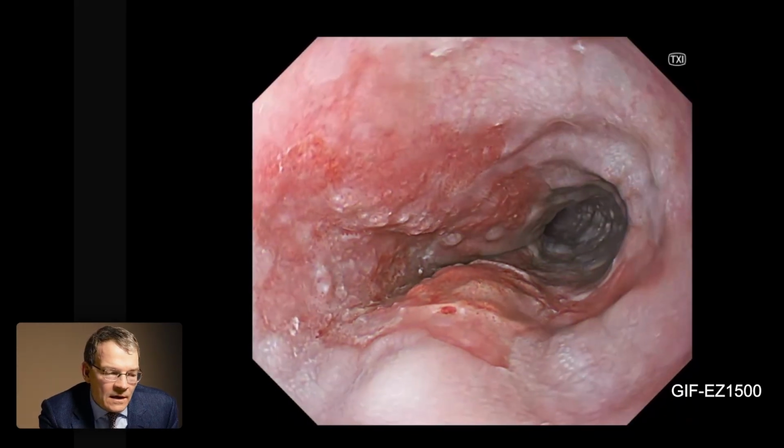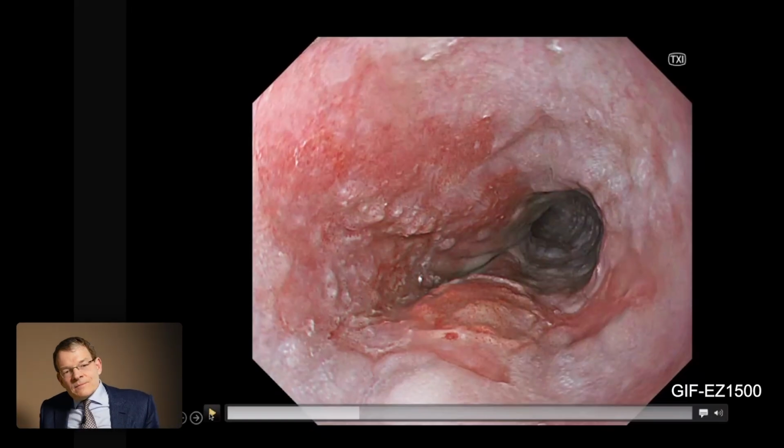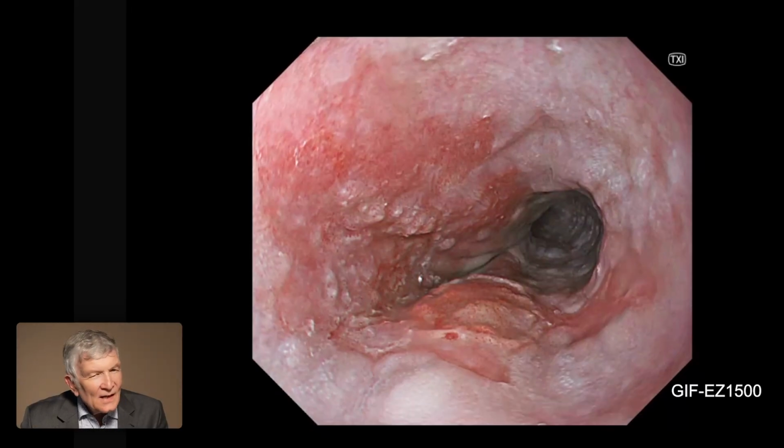And now I can stop here quickly. What's very interesting here is, of course, there's a clear lesion, but I think people should train their eyes for the surrounding redness, because sometimes you have a red spot which is very flat, and you think, I don't know what that is, but that's very, very suspicious. This is how it starts, and you can train your eye at the margin of those lesions. Exactly. Because sometimes they're infiltrating underneath and it's high-grade dysplasia at the margin, but this is the difficult abnormality if it comes alone.